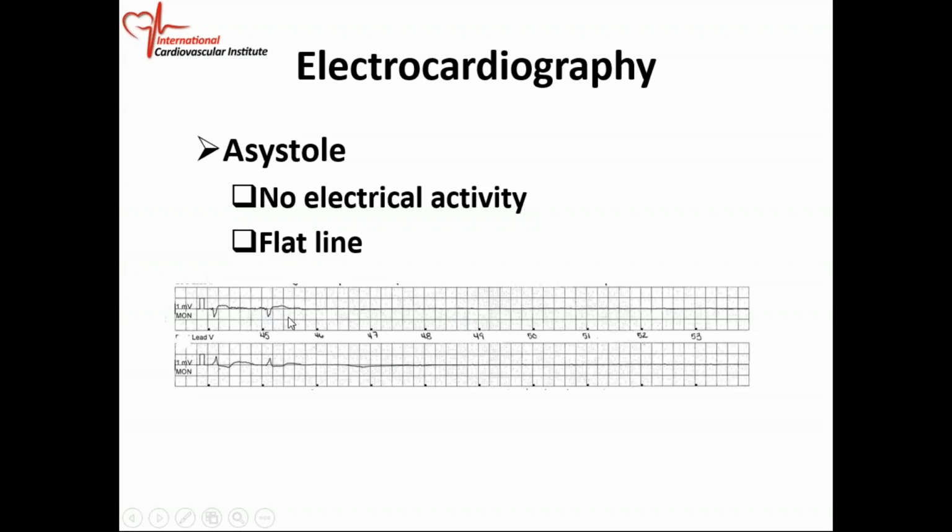He had been having fainting spells for about 2 years, and he came to the hospital and had one of his fainting spells. We put him on a monitor because we never catch anything, and he had one of his fainting spells, and this is what he did.